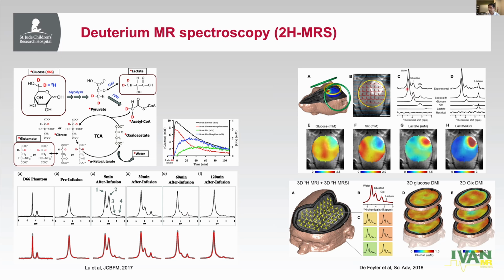And so you can see there's water in both the tumor voxels as well as healthy voxels, but you see a lot of glutamatergic metabolites versus lactate, which is a glycolytic product, in the tumor. So it gives you basically a sort of an energy core of the tumor.